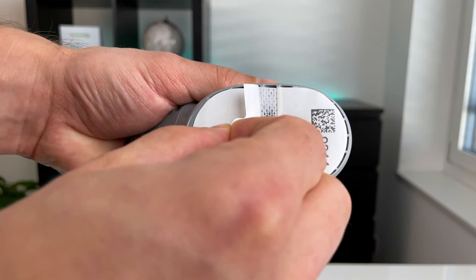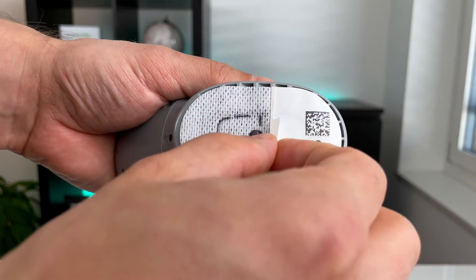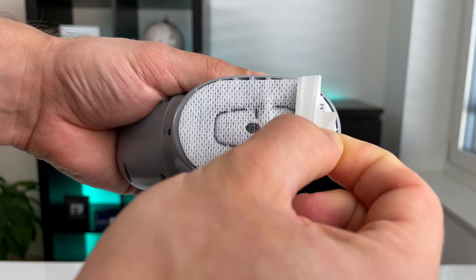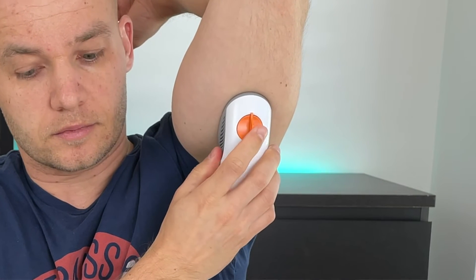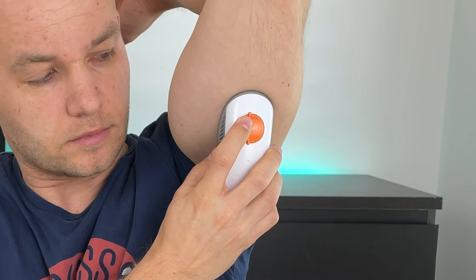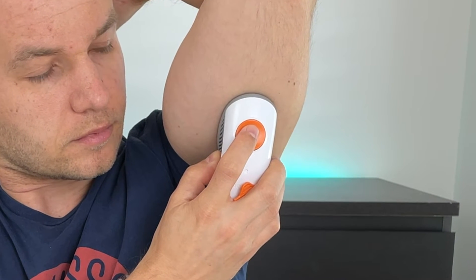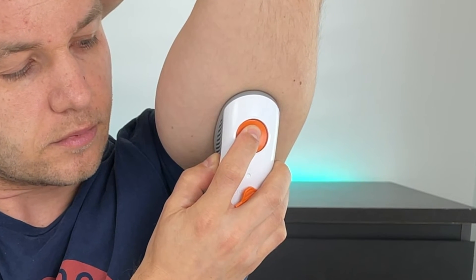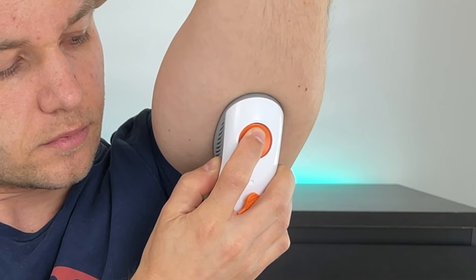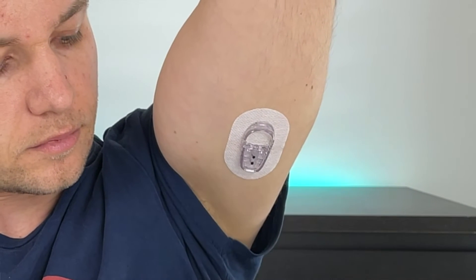While the skin is drying, peel off the labels from the sensor and keep the four-digit sensor code because you will need it to activate the sensor in a minute — don't throw it out. Try not to touch the adhesive, and place it directly on the dried-up spot you picked. Then fold and break off the orange safety guard and press the orange button to insert the sensor. I like to push the applicator a bit against my skin for a few seconds, just to make sure the patch sticks well, and then remove the applicator.